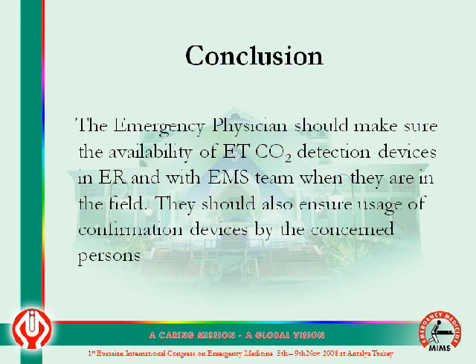Emergency physicians should make sure ETCO2 detection devices are available in the emergency room and with the EMS team when they are in the field. They should also ensure the usage of confirmation devices by the concerned persons.